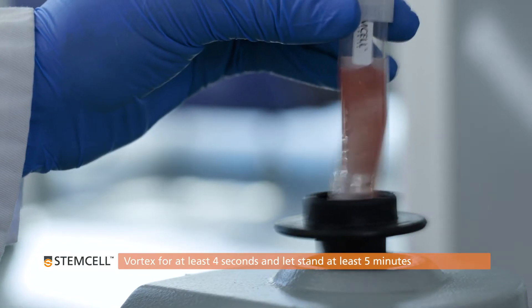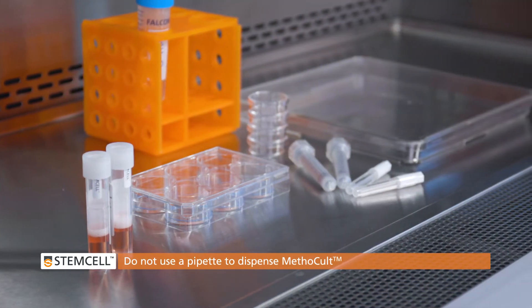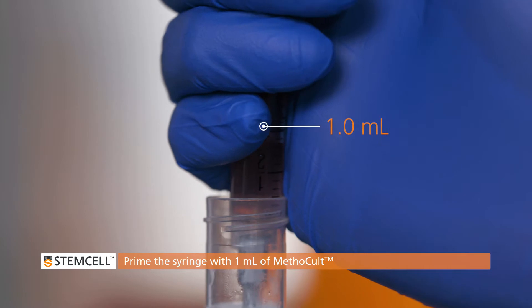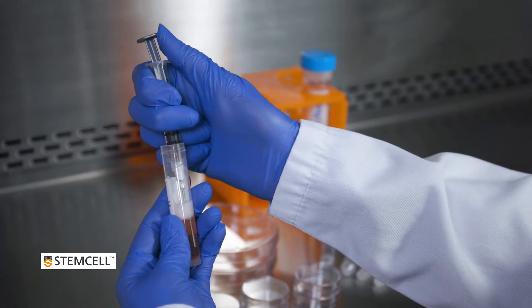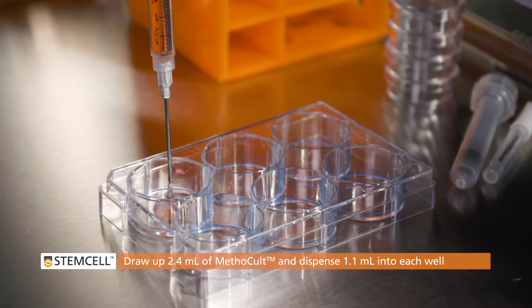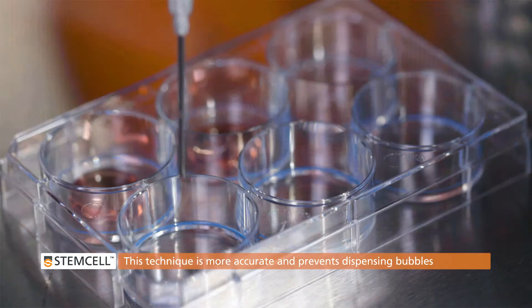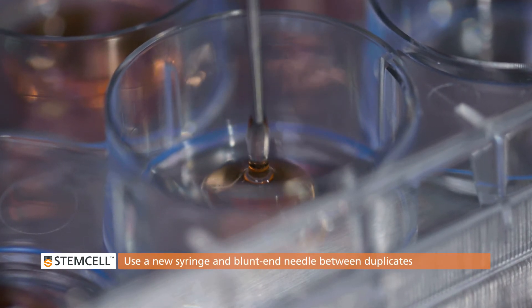Vortex vigorously for 4 seconds and let stand for at least 5 minutes. Take this time to prepare the culture ware. Do not use a pipette to dispense methicellulose medium as the volume will not be accurate. Use a 3 milliliter lure lock syringe attached to a 16 gauge blunt end needle to dispense Methicult. First, prime the syringe by drawing up 1 milliliter of Methicult, then depress the plunger to expel the medium and any air back into the tube. To plate dishes, we recommend drawing up to 2.4 milliliters, then dispensing 1.1 milliliters into the first well down to the 1.3 milliliter mark, and finally dispensing another 1.1 milliliters into the second well down to the 0.2 milliliter mark. This is more accurate than drawing up only 1.1 milliliters and dispensing to the zero mark, and will also help you avoid dispensing bubbles onto the dish. Use a new syringe and blunt end needle between duplicates to prevent contamination.